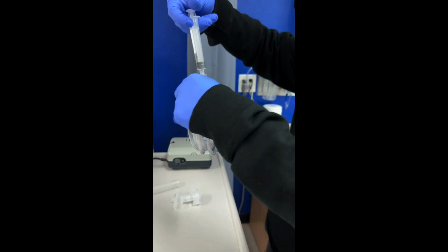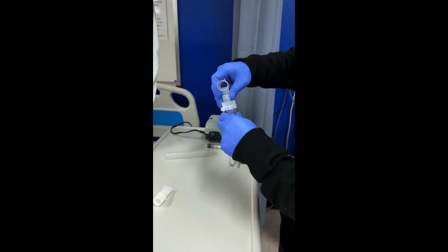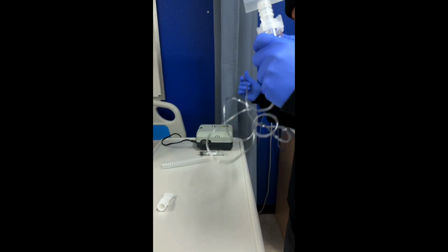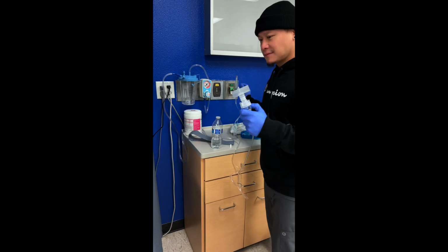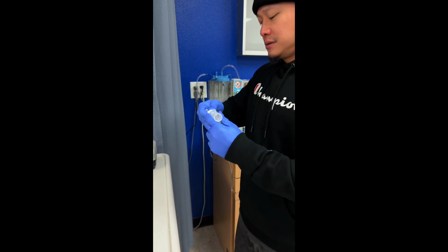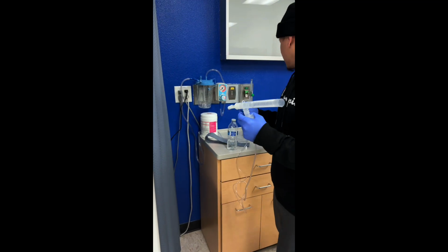Next, I securely close the nebulizer cup to prevent leaks. I then attach the mouthpiece or mask to the top of the nebulizer cup. After that, I connect the oxygen or air tubing to the bottom of the nebulizer. The tubing is connected to a flow meter, and the flow is set to 6 to 8 liters per minute, which allows proper aerosol generation.